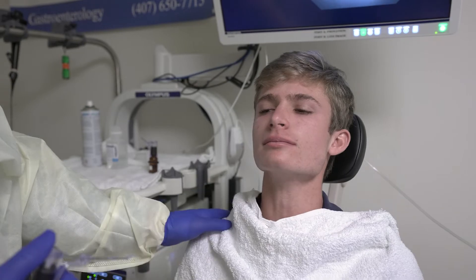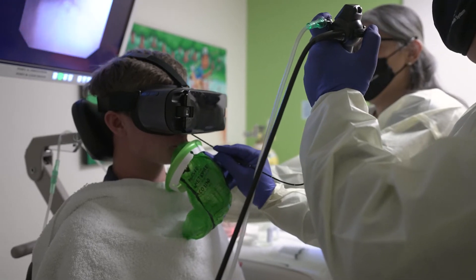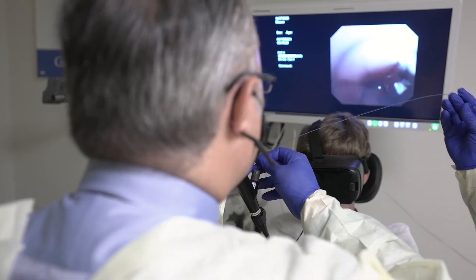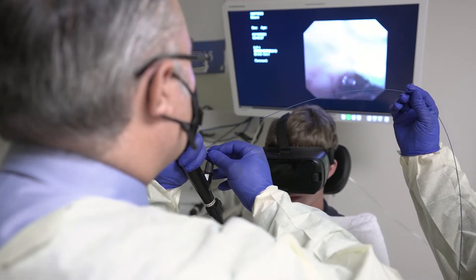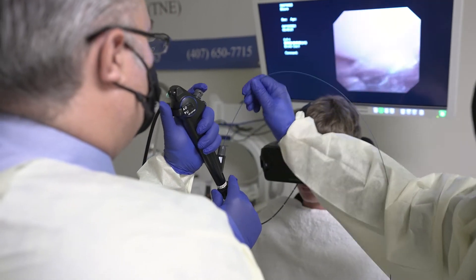A narrow tube with a camera and a little claw at the end is inserted down through the nose and throat. They take little biopsies to count the number of eosinophils, which determines which foods the patient can eat or may have to eliminate. We look under the microscope for active inflammation or swelling, and count the number of eosinophils present in the esophageal tissue.